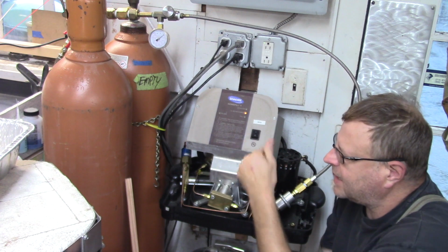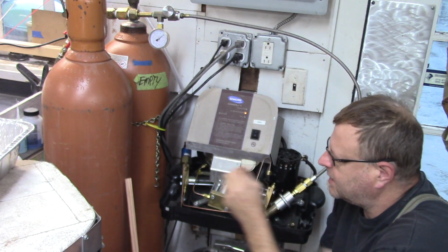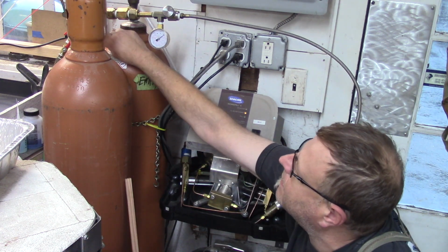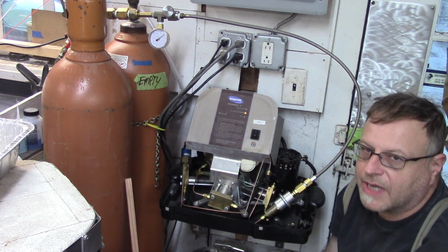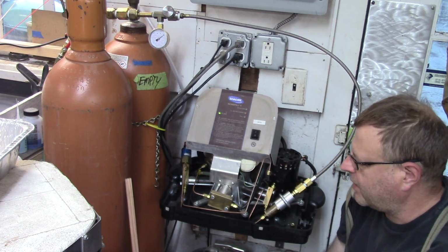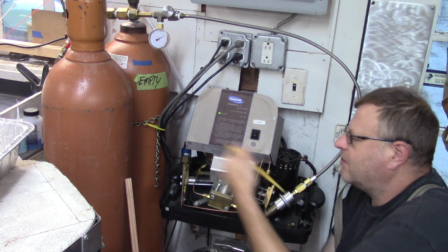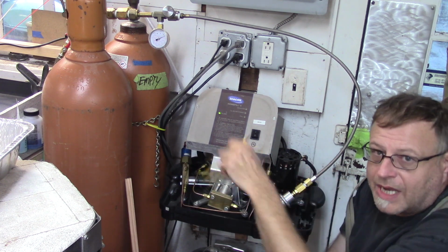Because I disconnected the system, you'll see it go out of balance, because I disconnected cylinders number 4 and number 5. This does this all the time. This isn't because I disconnected it, this was the way it runs. Okay, so because I disconnected cylinders number 4 and number 5 from the system, it's no longer in balance pressure-wise inside the machine.